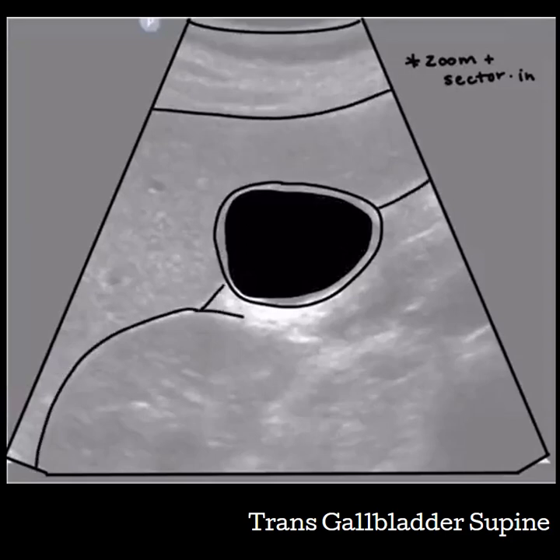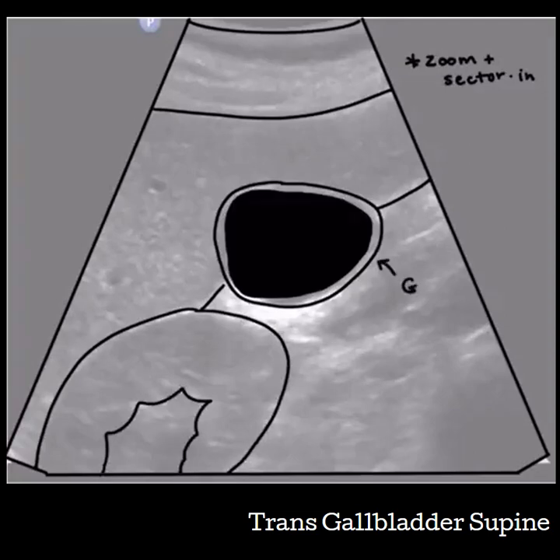When the patient is supine, the fundus of the gallbladder hangs down towards the feet. You may be able to see the kidney in this image because of its position. Make sure to clear out artifact of the gallbladder. This image is often used to measure the gallbladder wall. You'll want to choose an anterior portion of the wall where the liver and gallbladder are adjacent for the best measurement. Never measure the posterior wall of your gallbladder.